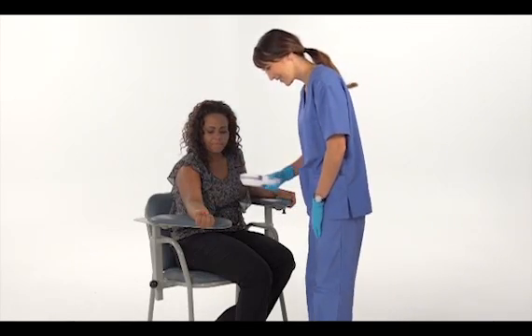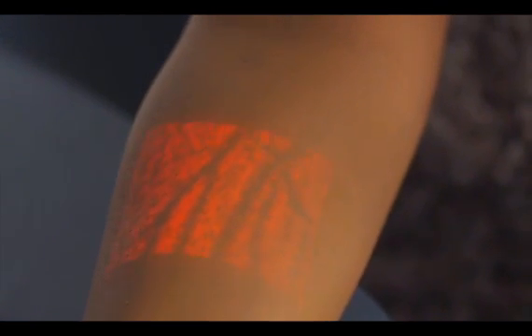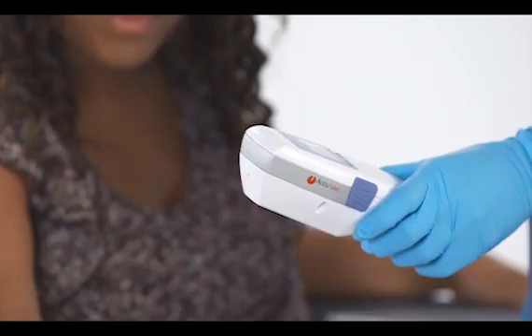This helps with IV starts, blood draws, and any other procedures where viewing the vasculature would be beneficial. The AccuVein AV400, used as an assessment tool, can help you locate the best vein by visually verifying vein patency and allowing you to avoid valves and bifurcations.